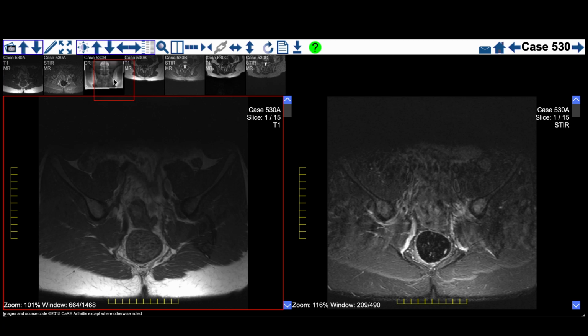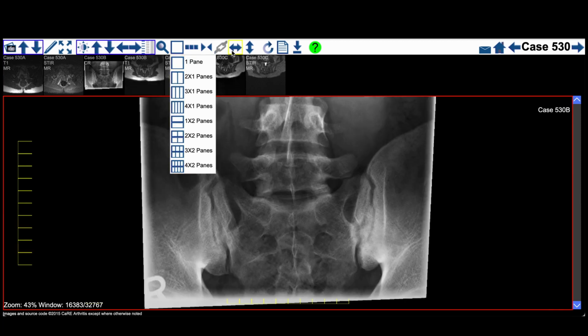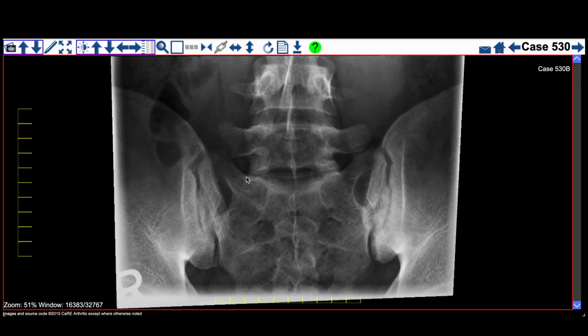So what did his x-ray look like the first time he came to see me? So let's focus on just the X-ray.